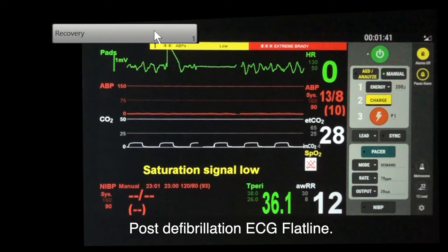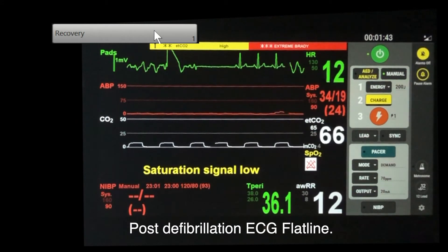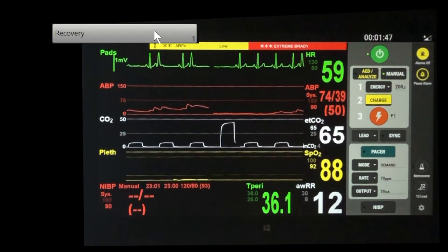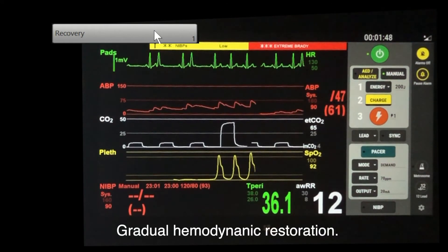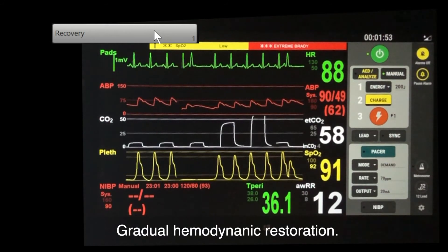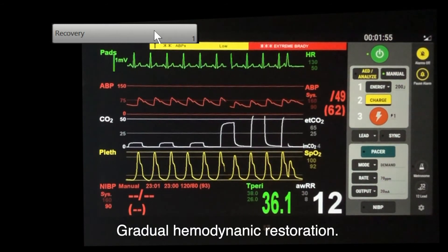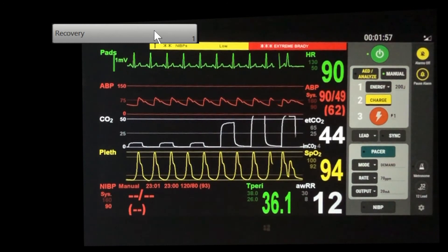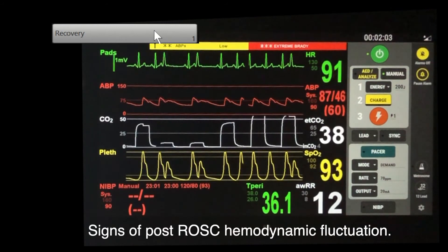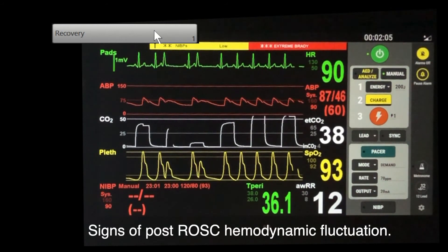The gradual rise of heart rate, blood pressure, and saturation reflects progressive hemodynamic status. Meanwhile, the PVC and CO2 indicate post-ROSC parameter fluctuations.